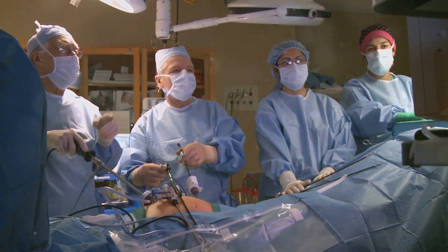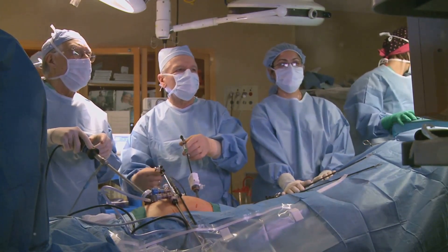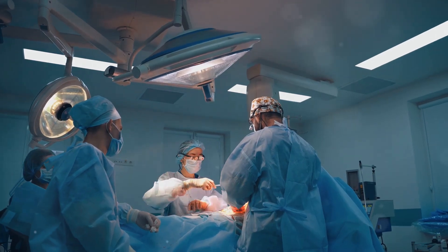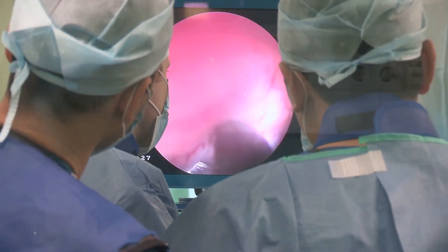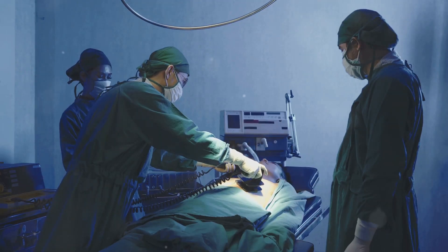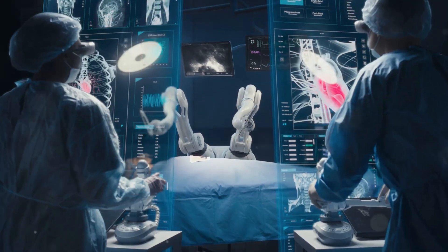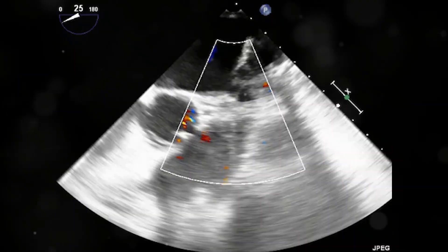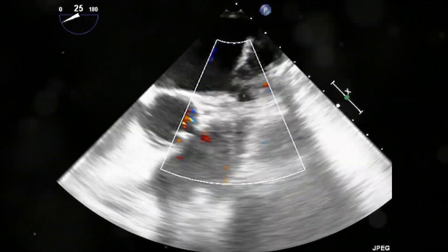Laparoscopy is a minimally invasive procedure for visualizing pelvic organs. It uses small incisions, leading to faster recovery than open surgery. A laparoscope is inserted through a small incision and transmits images to a monitor, providing a magnified view. Laparoscopy can be both diagnostic and therapeutic, helping identify conditions like endometriosis and adhesions.